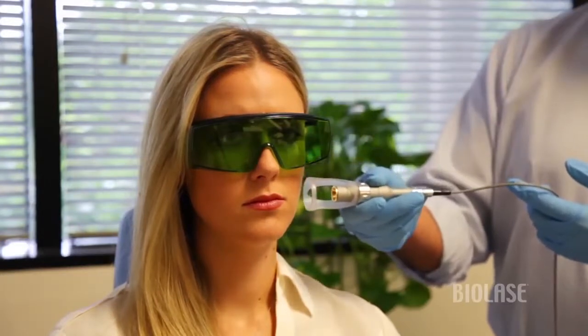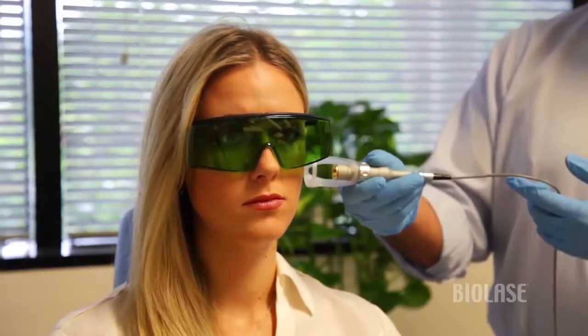The typical treatment will be about five to ten minutes, and the effect has been shown to last about 48 hours, so you'll do this about two or three times per week for the first week and follow up after that.